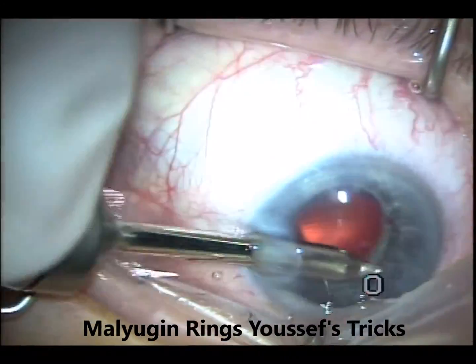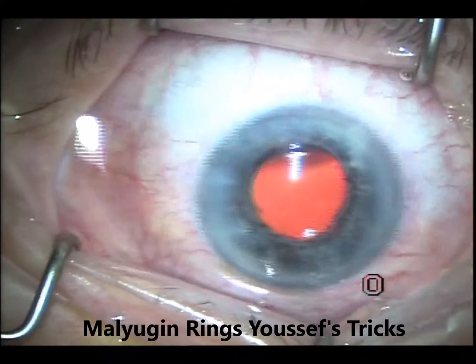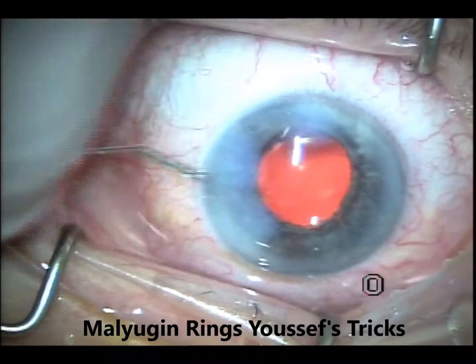It's very easy to implant and explant, and this is my best way to manage small pupils for years now, actually. Works great. This is just the moxifloxacin injection at the end.